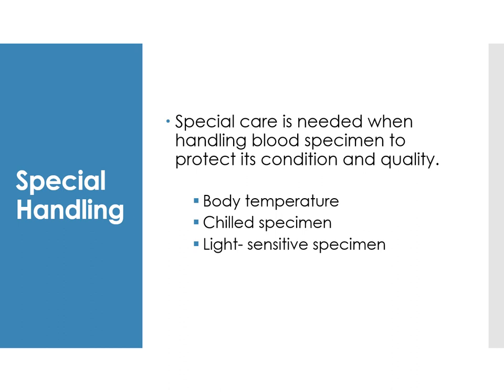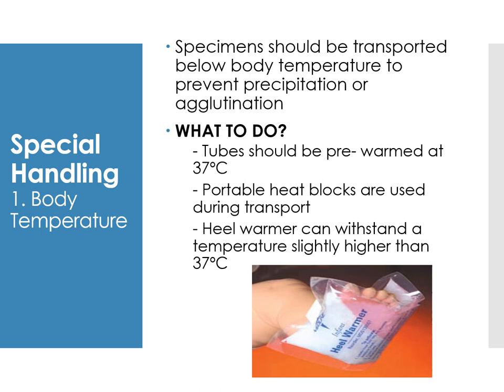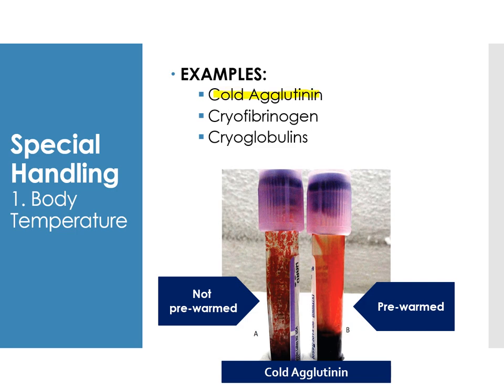Special care is needed when handling blood specimens to protect their condition and quality. Body temperature is important — some specimens need to be kept warm while others need to be chilled, and some are light sensitive. For body temperature specimens, the tube should be pre-warmed at 37 degrees Celsius. Portable heat blocks or heel warmers can also be used. Examples include cold agglutinin, cryofibrinogen, and cryoglobulins.